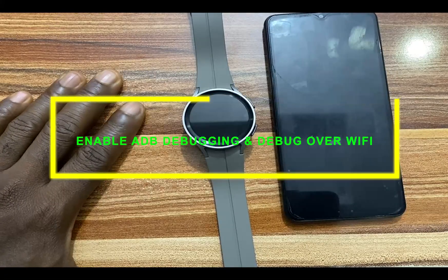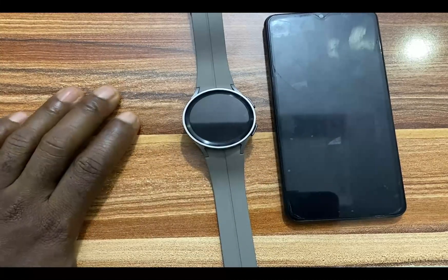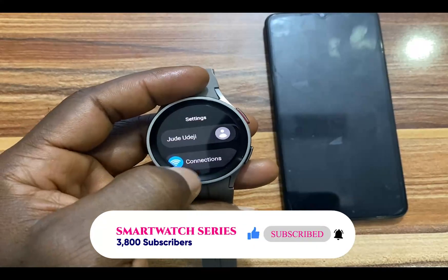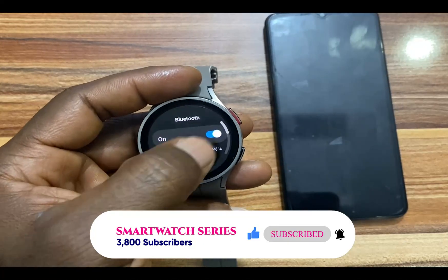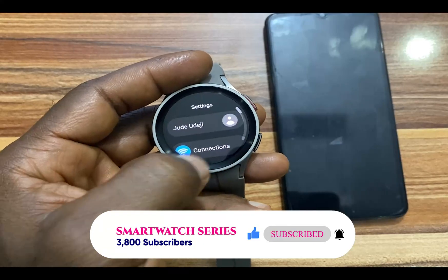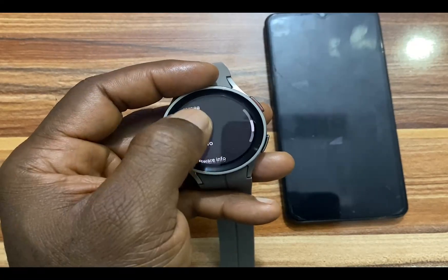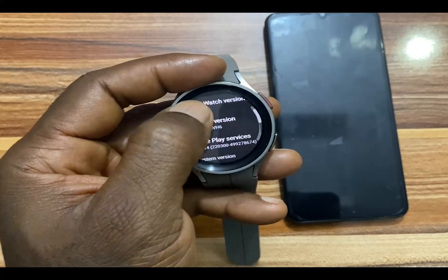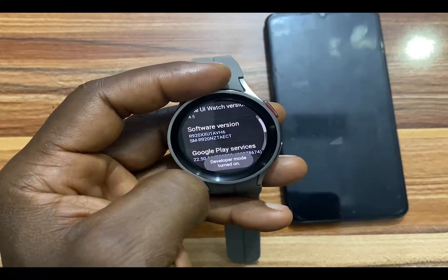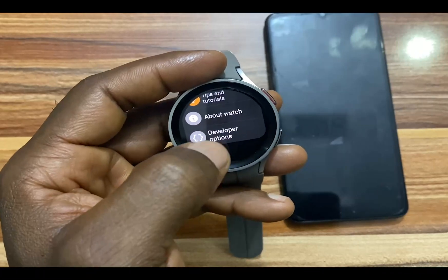Next, we need to get the Galaxy Watch 5 Pro ready to receive the app. For you to be able to remotely install the app, we need to have both watch and phone on the same Wi-Fi network. So go ahead and open the settings app, go to connections, turn off Bluetooth, and have Wi-Fi enabled. Next, scroll down to where it says about watch. Tap on that, go to software info, and tap on software version multiple times to enable developer mode. You can see where it says developer mode turned on. Then go back and you should have developer options right under about watch.